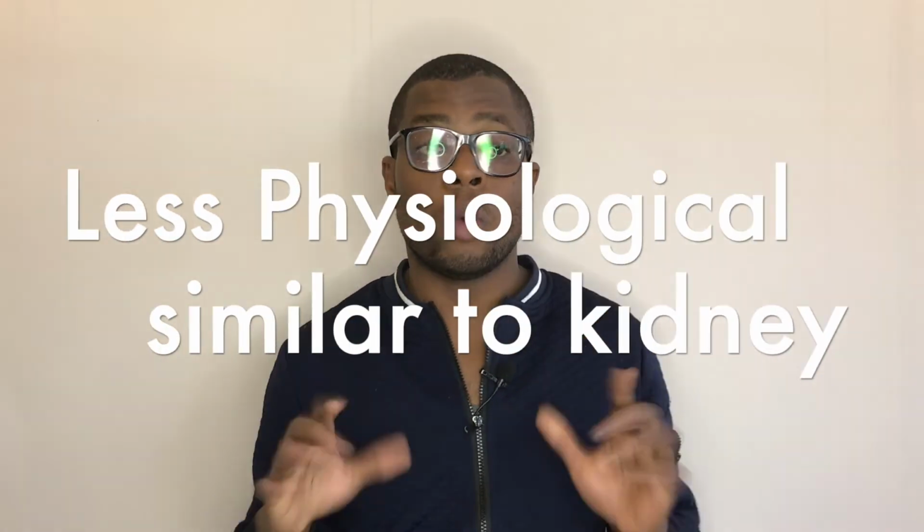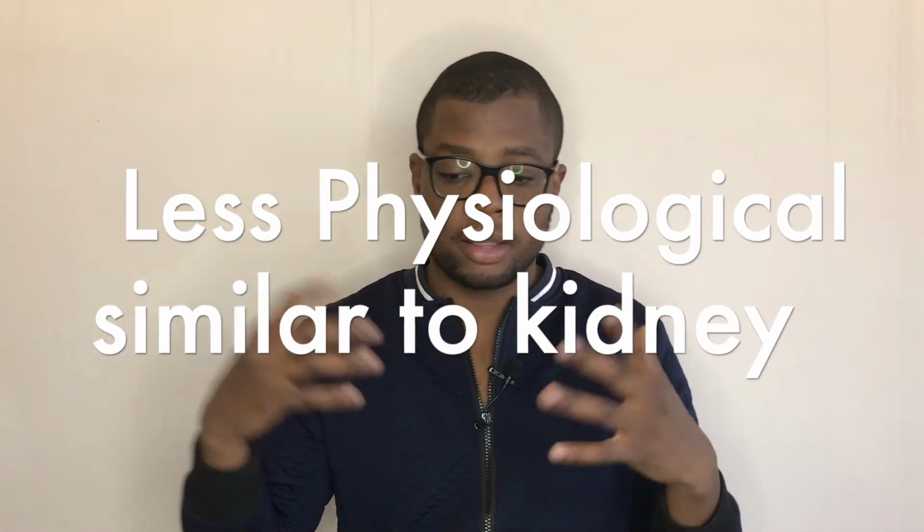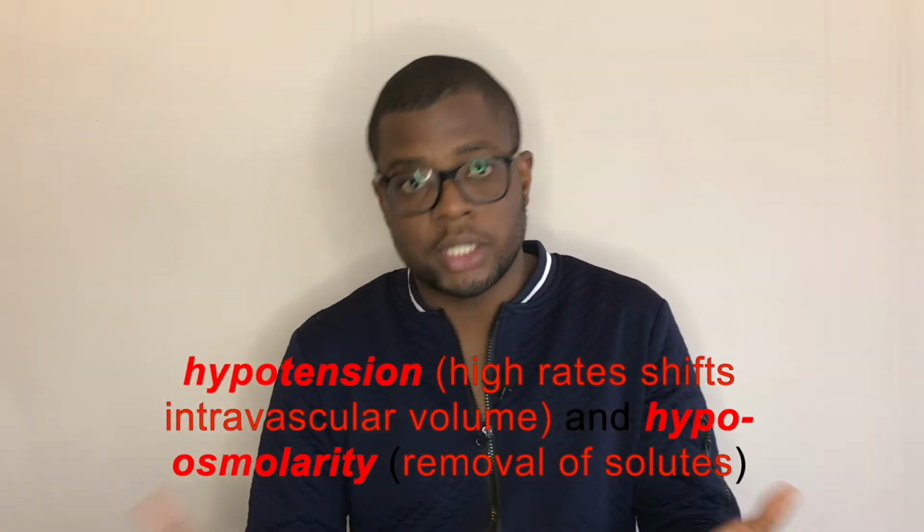But the downside though is that it is way less physiological. Remember, the kidney and the dialyzer, it's not a physiological process, and so you risk having hypotension or something like hypo-osmolarity, and the fact that it requires vascular access.